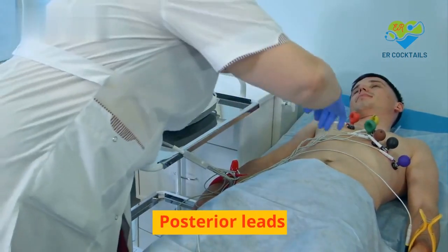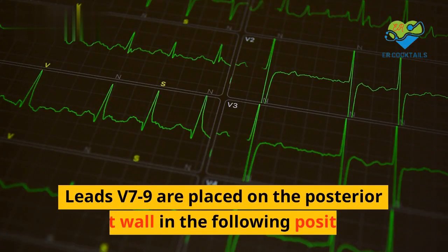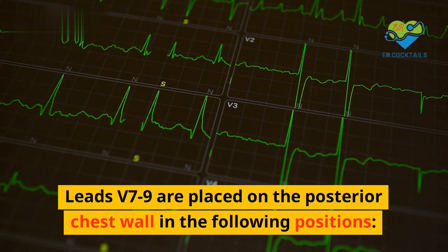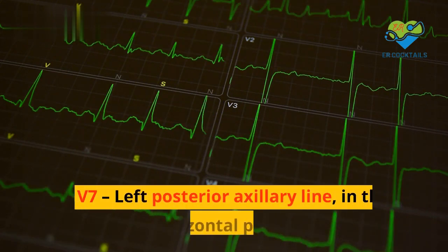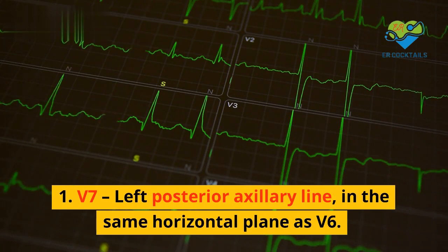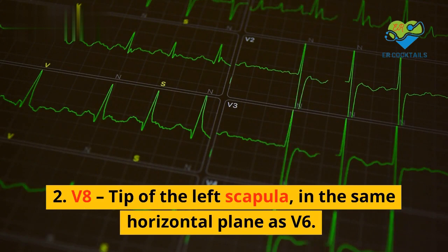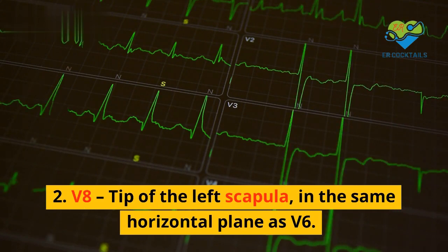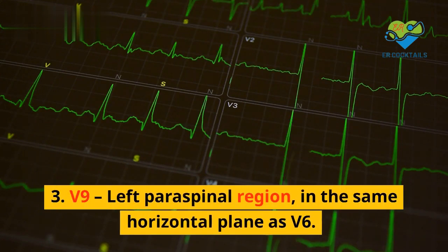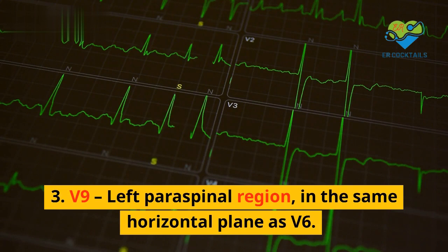Posterior leads. Leads V7 to V9 are placed on the posterior chest wall in the following positions. 1. V7, left posterior axillary line, in the same horizontal plane as V6. 2. V8, tip of the left scapula, in the same horizontal plane as V6. 3. V9, left paraspinal region, in the same horizontal plane as V6.